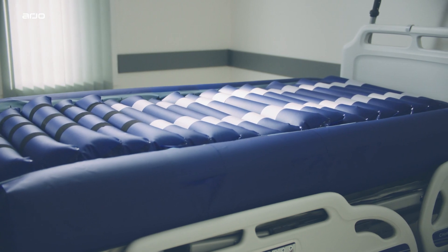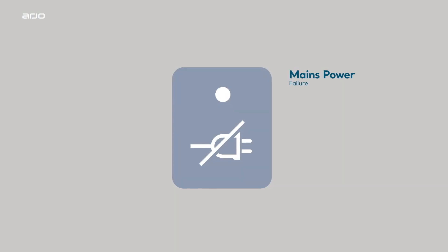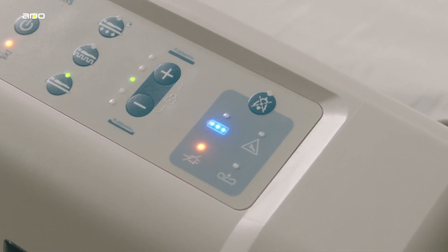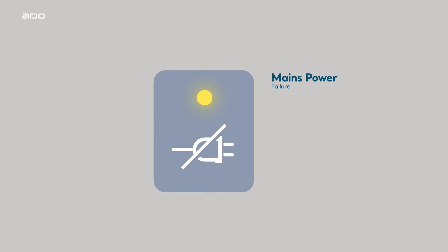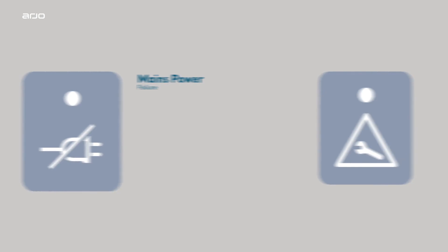The Oralis Plus mattress takes approximately 17 minutes to reach full inflation. On the right-hand side of the pump control panel, the mains power failure indicator is activated when a mains power failure has been detected. The indicator is shown for information only, whilst the pump continues to operate normally using the battery with no audible alarm.